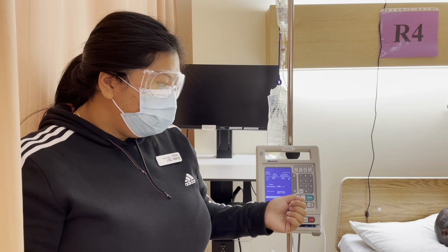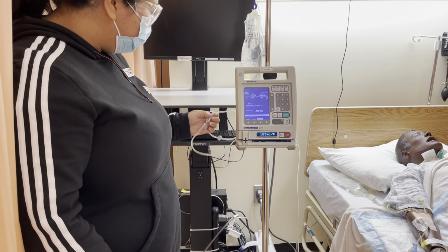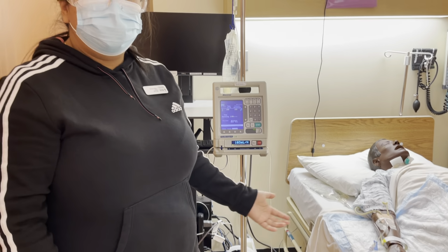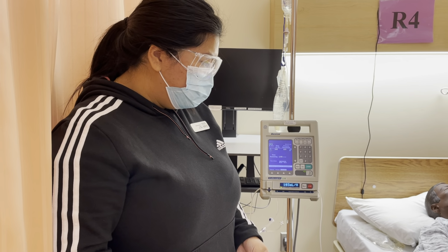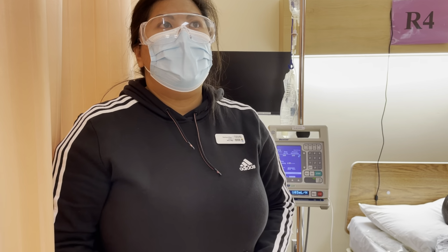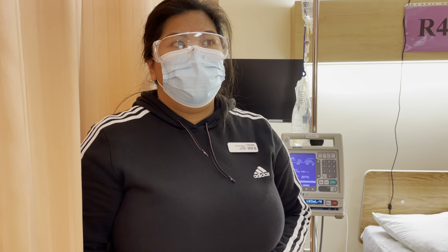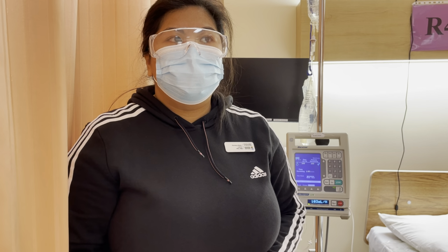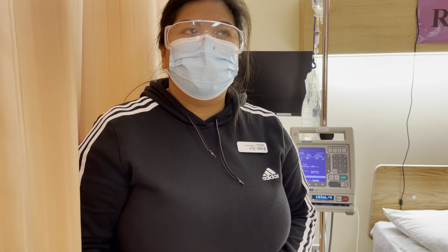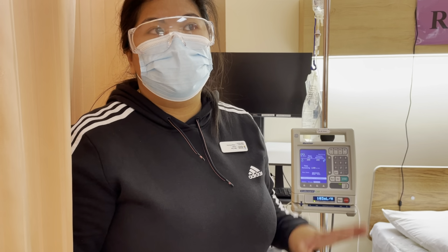Make sure they're comfortable, that all of the lines are connected, and there's no kinks in my tubing. And I'm also going to document on my MAR right away, sign it right away. I am going to document on our patient's fluid balance sheet, and also I'm going to be back in half an hour just to assess our patient for side effects, and in an hour to make sure that all of the medication has infused.